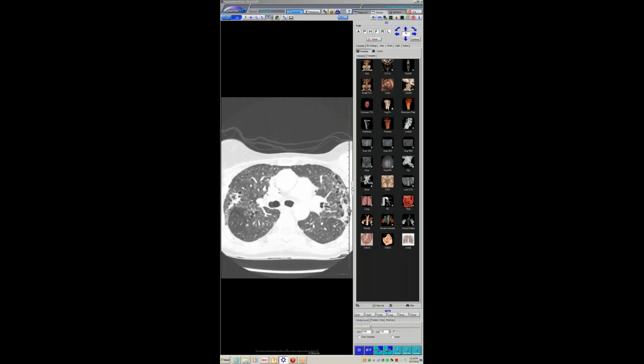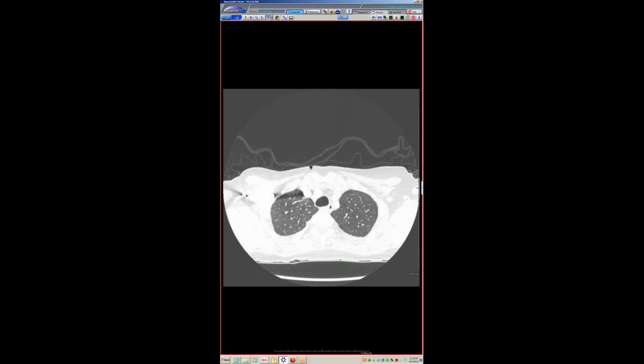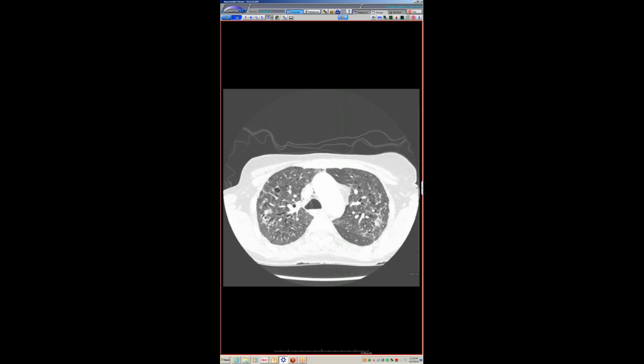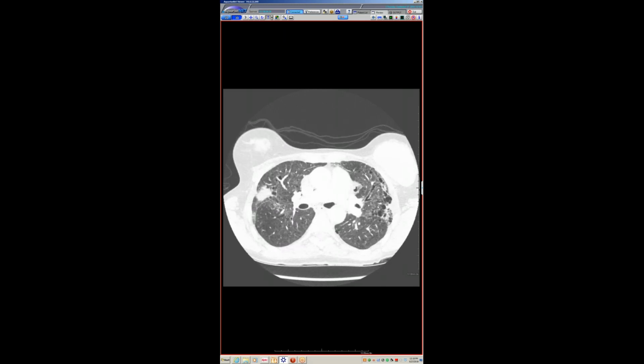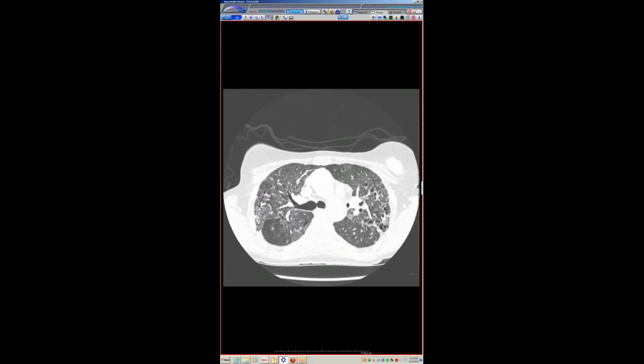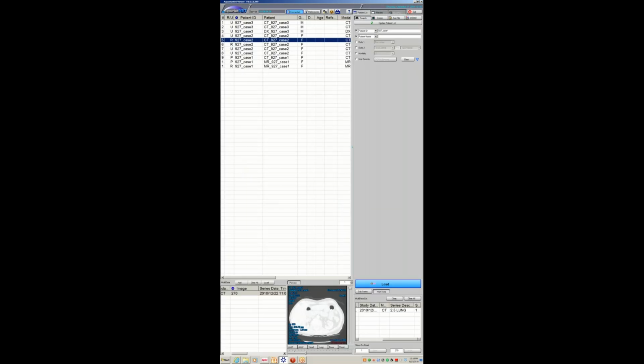So that was 2009. This is like 18 months later, she starts developing these strange upper lobe nodules, which could potentially be described as peribronchiolar or perilymphatic. Some of these are definitely peribronchovascular, some peripheral nodules. There's some fibrosis, the airways are pulled apart in some areas. And this process worsens, and she undergoes a right lung transplant.